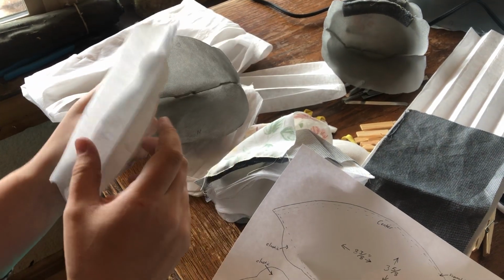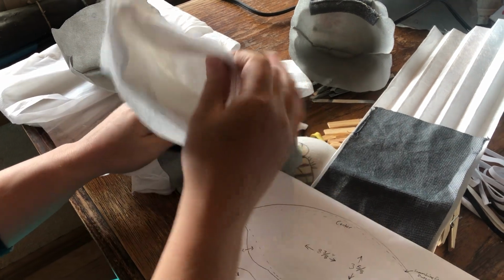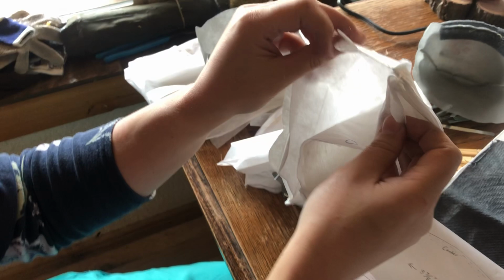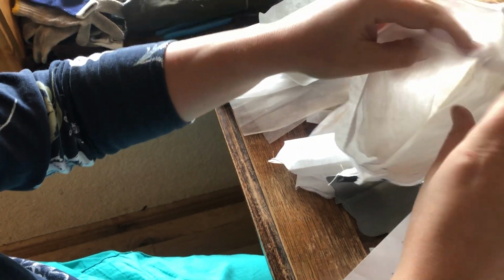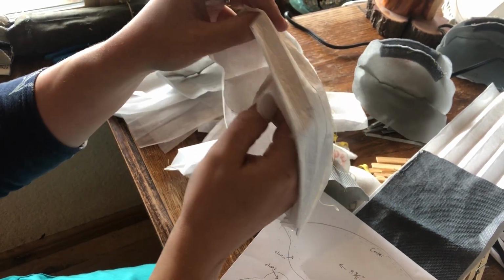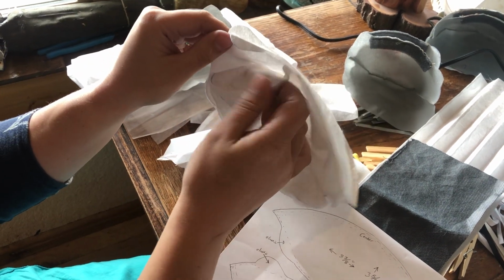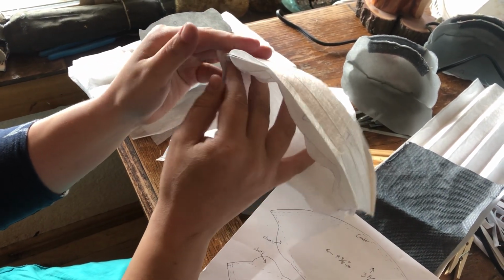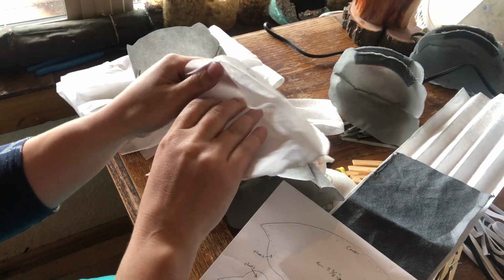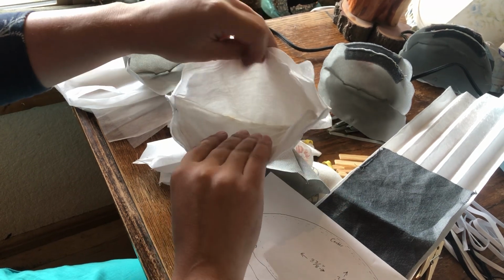And then I took this piece, here's the one I did, and I put my lightweight interfacing on the inside. So I've got my seam going up on my soft interfacing. I have the seam also going up towards it. And then I just folded it back and I tacked it with hot glue. And the hot glue really holds onto this interfacing fabric, so don't worry about it coming loose. It did not come loose in the washing machine. The dryer was too hot for the hot glue, sad to say. So anyway, this is coming out pretty good here.